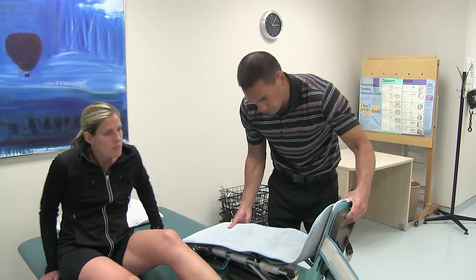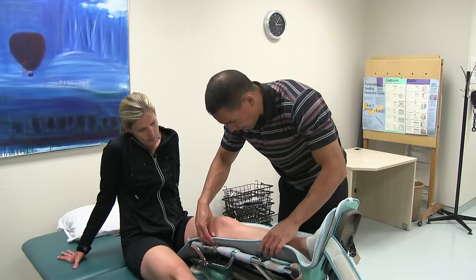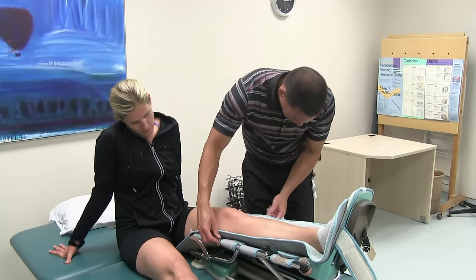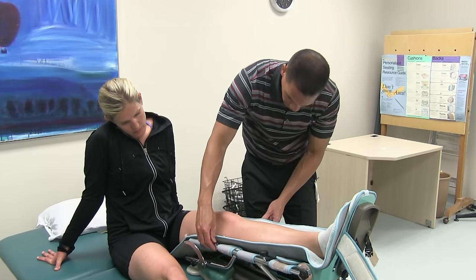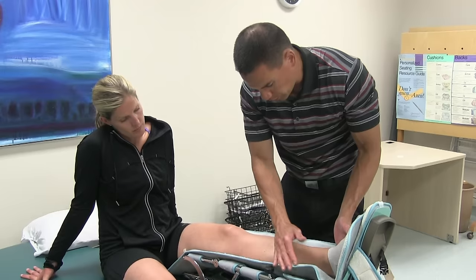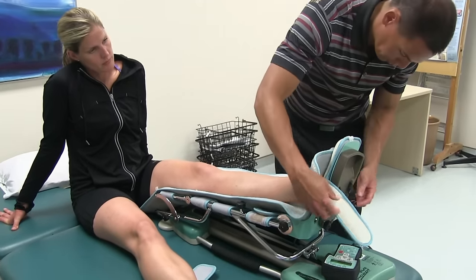We get Carolyn to slip her leg into the CPM machine. We want to make sure the machine bends where the knee would normally bend. For her lower leg, the distance looks approximately correct. We quickly adjust the foot pedal as well.